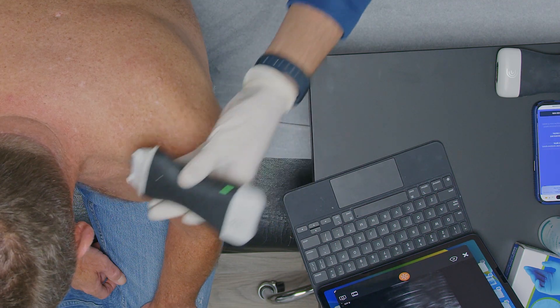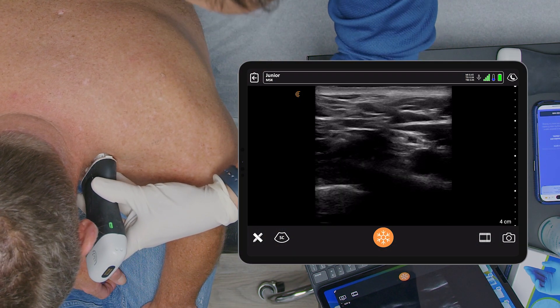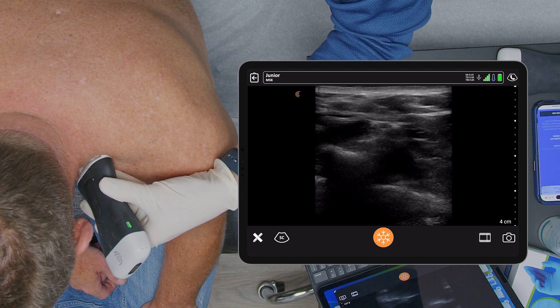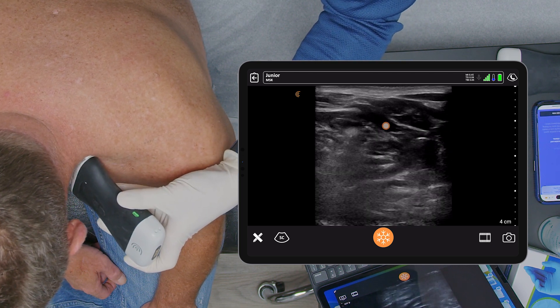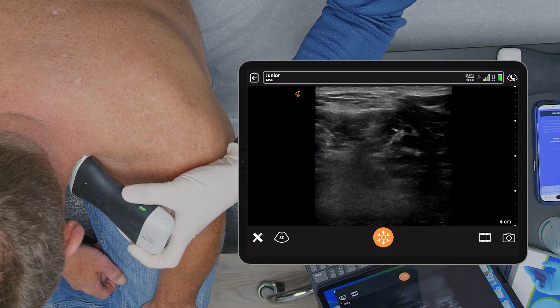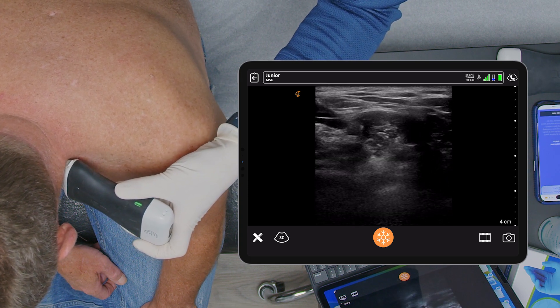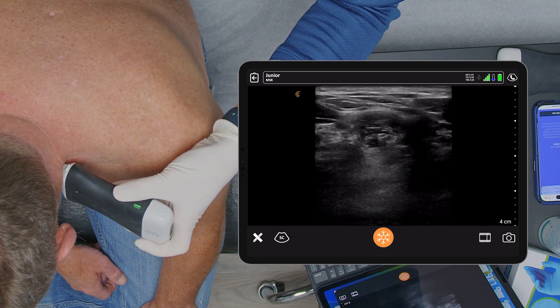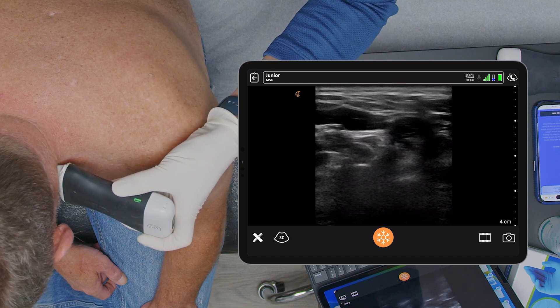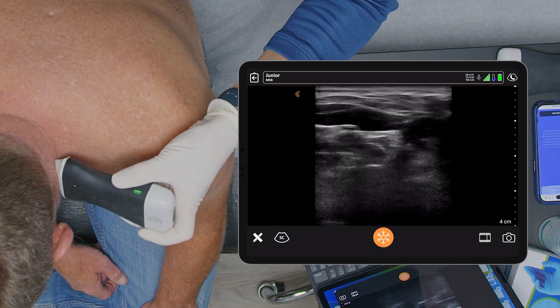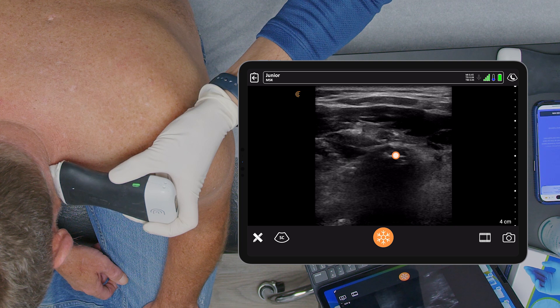First, I'm going to scan his neck. I'm finding the supraclavicular brachial plexus, which I trace up the spine to the extraforaminal space. We're tracing the nerves as they go back into the foramen. The nerves are hypoechoic and they're disappearing. That right there is a posterior tubercle, and here is the articular pillar of the spine.